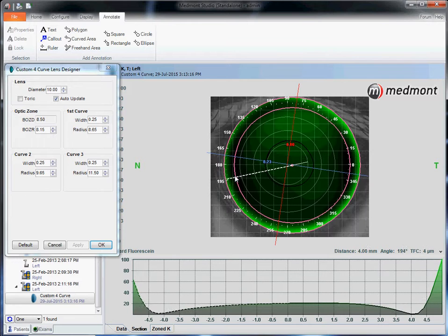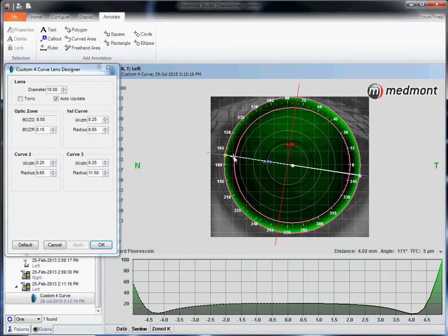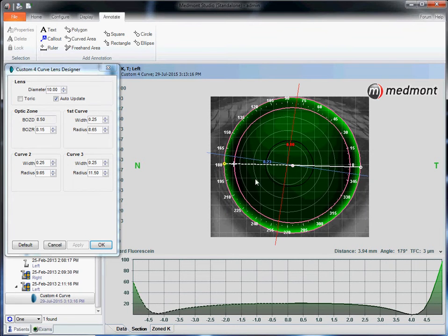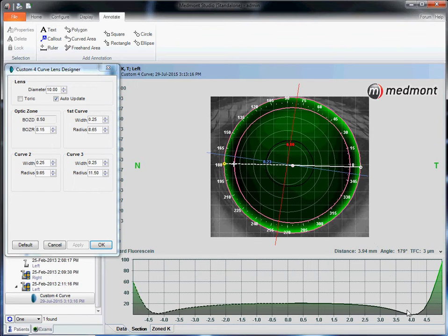Let's look for the point where the lens lands on two opposing sides and we see that here: landing at three o'clock and landing at nine o'clock. So this lens will have good lateral centration with its landing at three and nine o'clock.